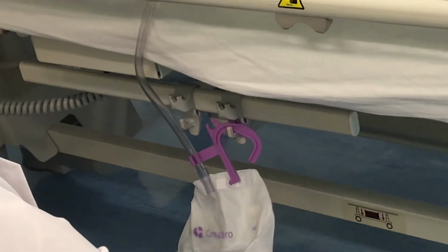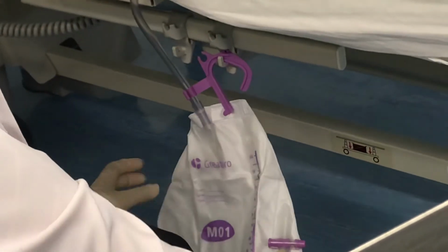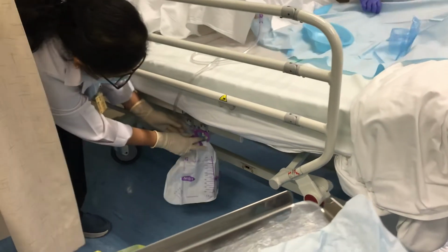See, these are the areas for that. The tip is here, it's a guard, and two hooks are there, on both sides. So you can hang it.